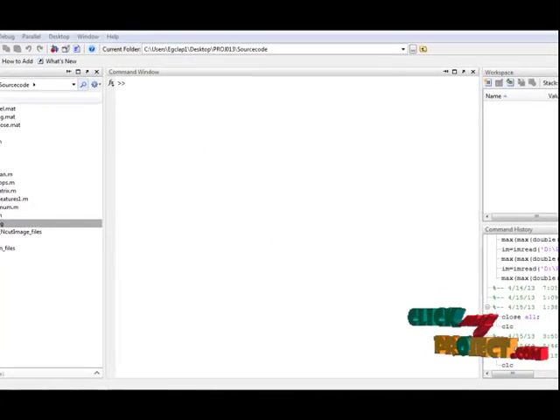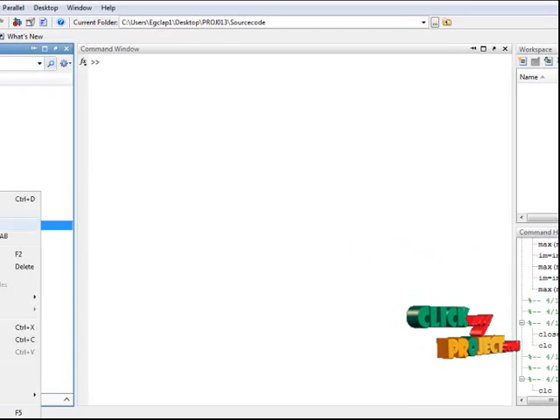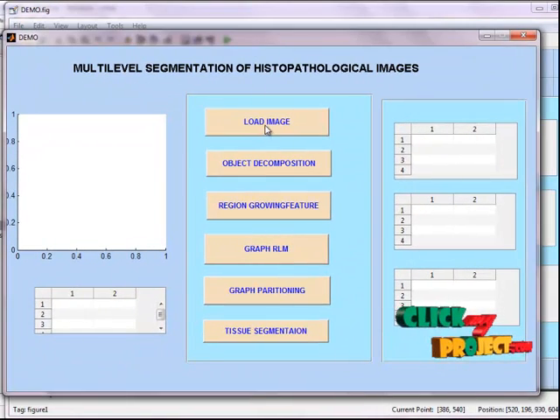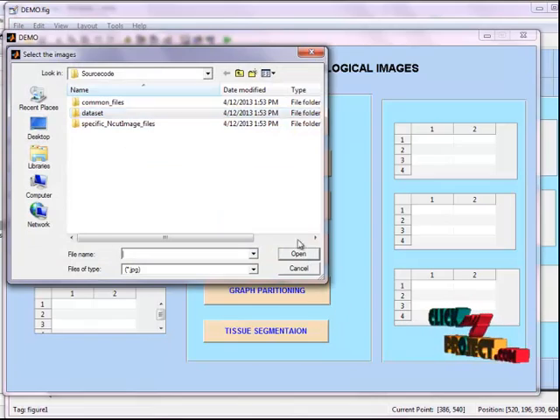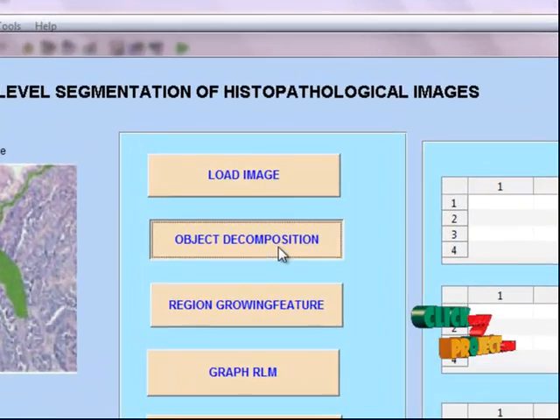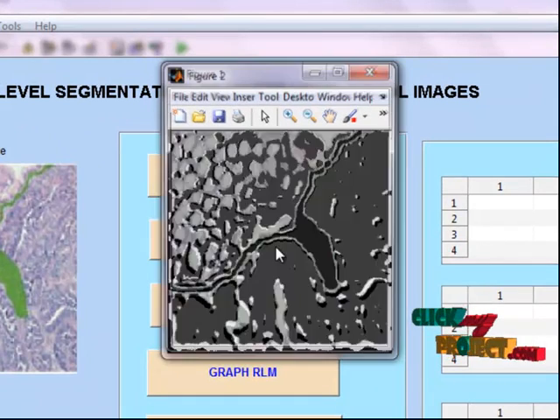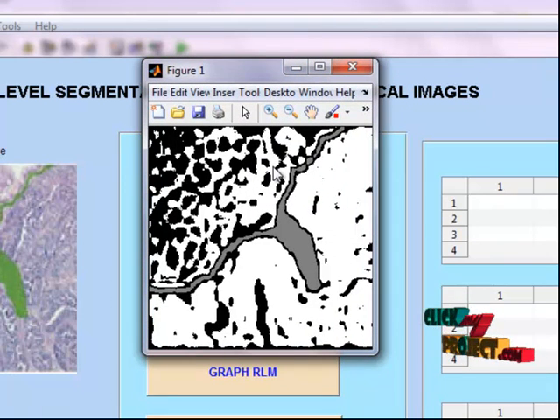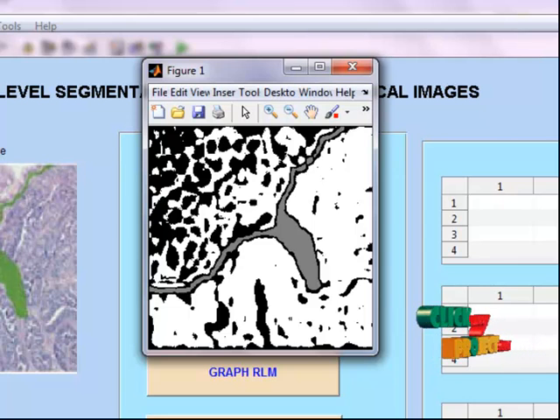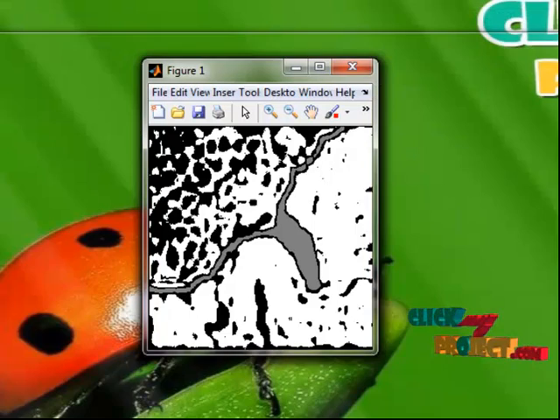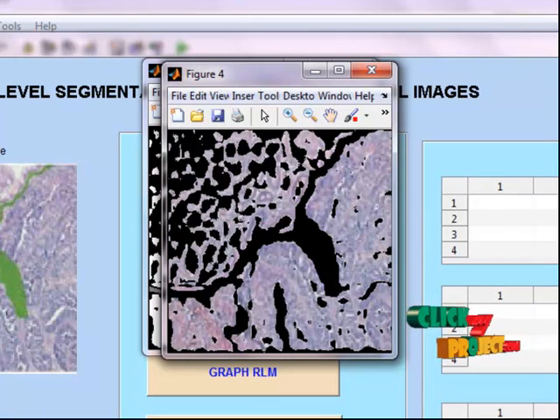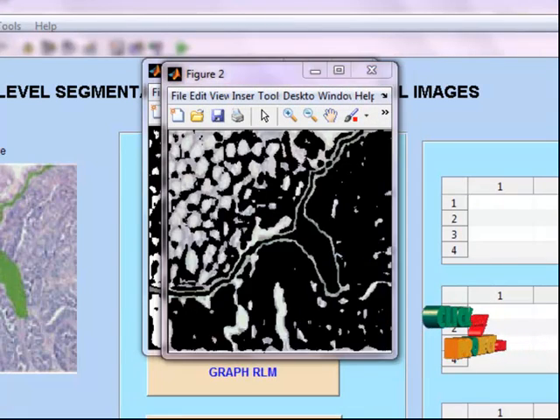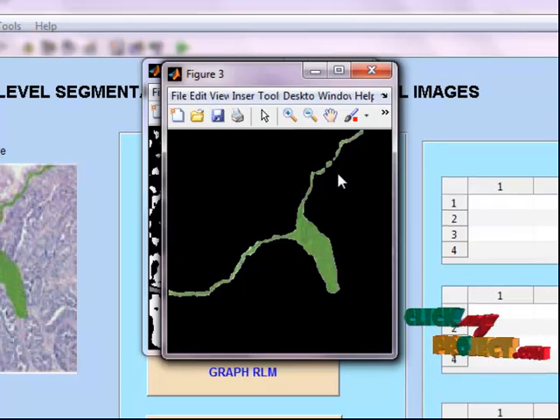Now let's see the execution part. I have the demo figure file. Select the file, then right-click, open in GUI, then run the file and select the load image button. Here we have to select the input image and next do object decomposition. Select the result of pixel labels — this is the segmented result of histopathological tissue image segmentation showing object cluster 1, object cluster 2, and object cluster 3 using the k-means algorithm.